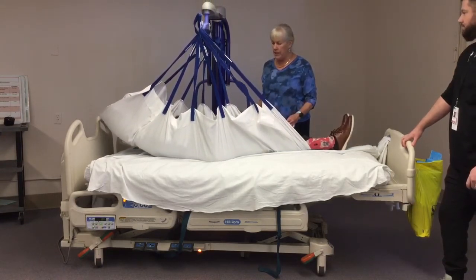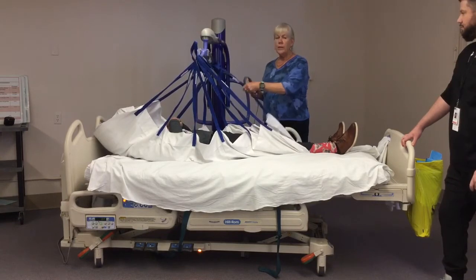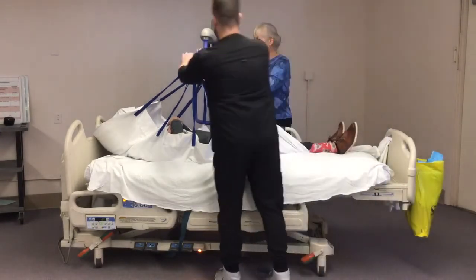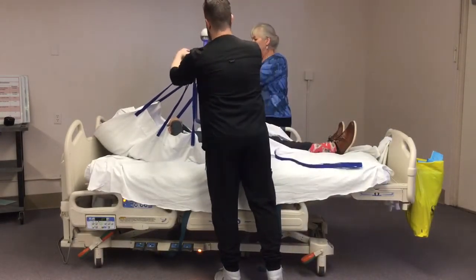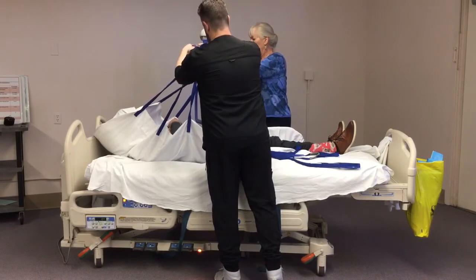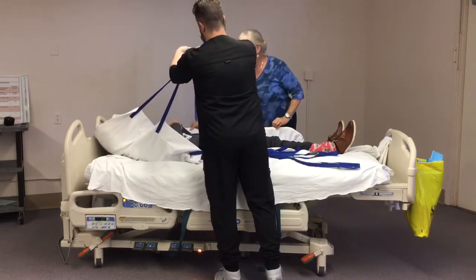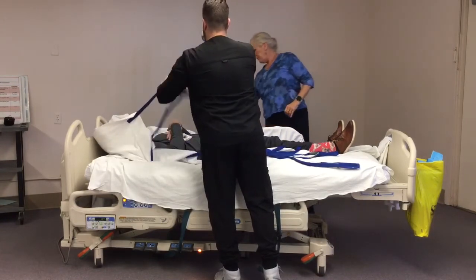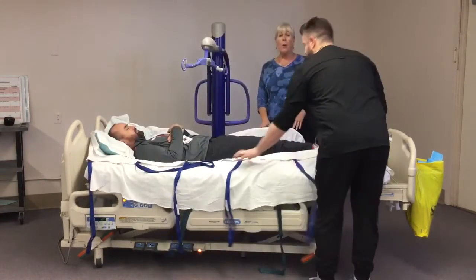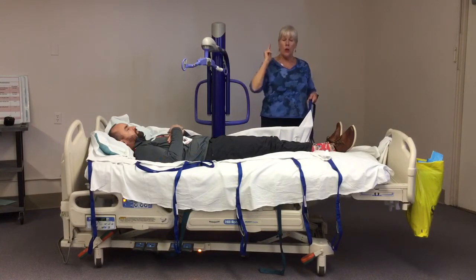So now he's right at the edge of the bed. I'm going to lower him down till I get some slack in these straps. I'm going to take them all off. Okay. Now I'm only going to use the loops on this side because I'm moving my patient, rolling him so that he's facing you.